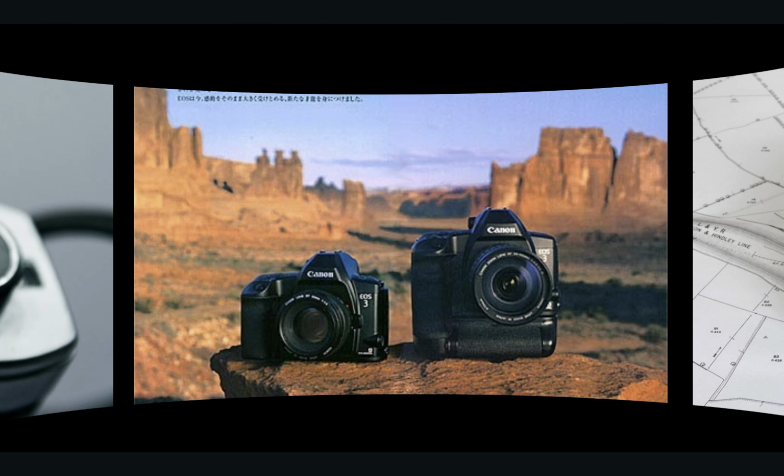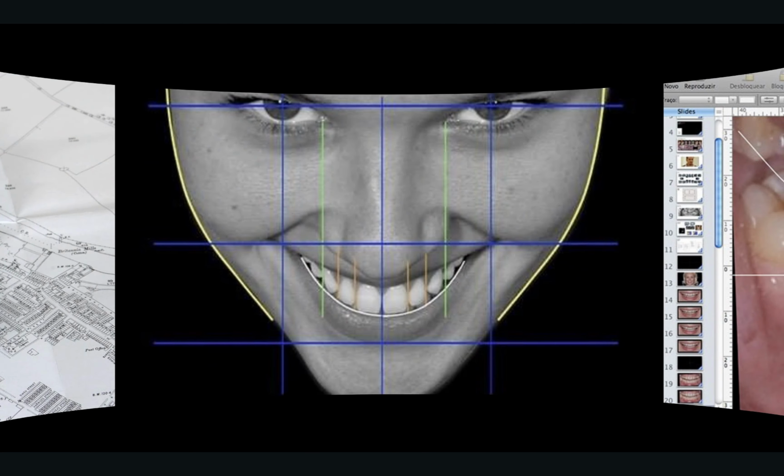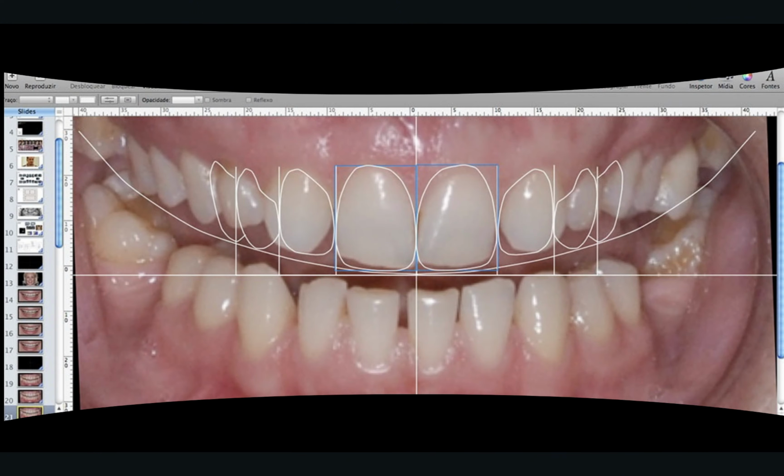This gave dentists the ability to have real-time feedback, and they were able to convert them into JPEG files and move them to computers so that they could help them communicate visual treatment goals with patients and with labs. It sounds so simple, so duh. Like, of course they could use a JPEG. Then you could move it into a PowerPoint or a Keynote. But this was revolutionary. This was a quantum leap forwards in cosmetic aesthetic dentistry.